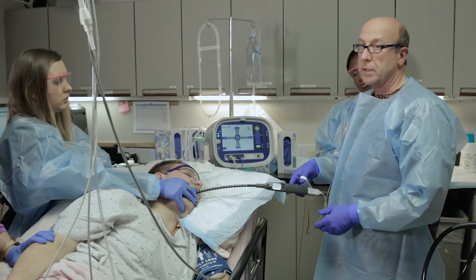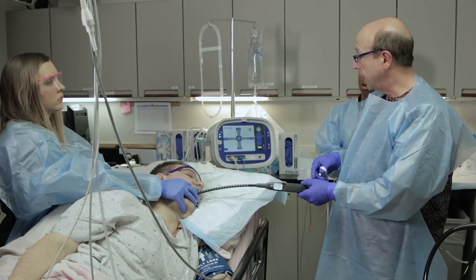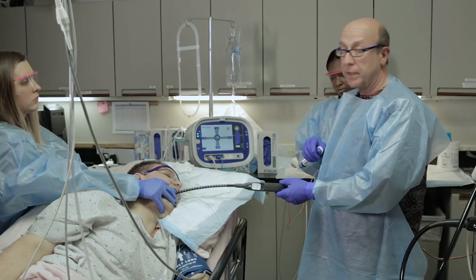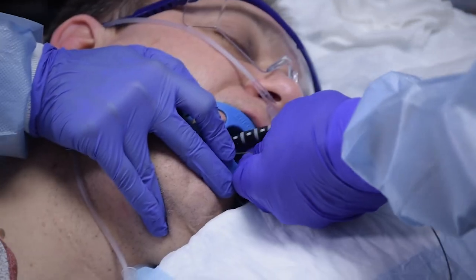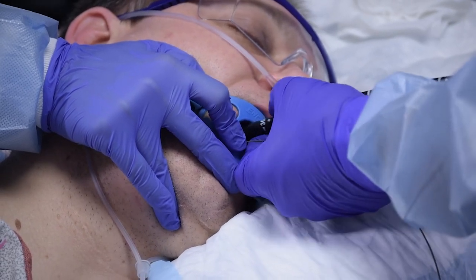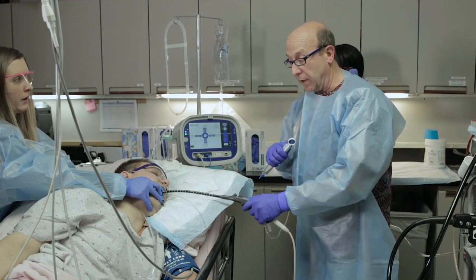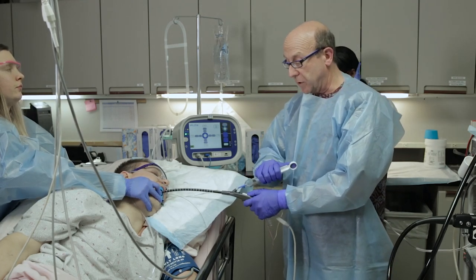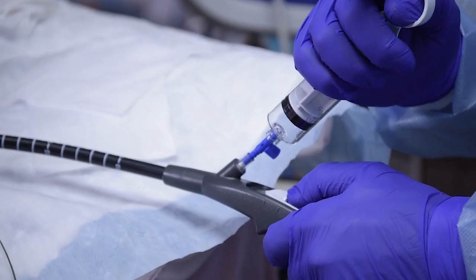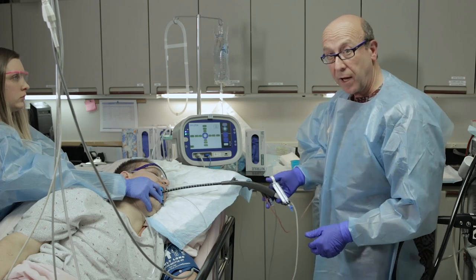With regard to the number of treatments in the esophagus, there are four levels of treatment each a half centimeter apart, and there are two treatments at each level — a total of eight treatments, each one minute long. It roughly takes about nine minutes to complete the esophageal phase. Again, the importance of proper technique: removing the catheter, re-elongating the esophagus, moving to the next treatment level — now a half centimeter above our z-line. When properly performed, these treatments are always placed in exactly the right positions for maximal effect over time.